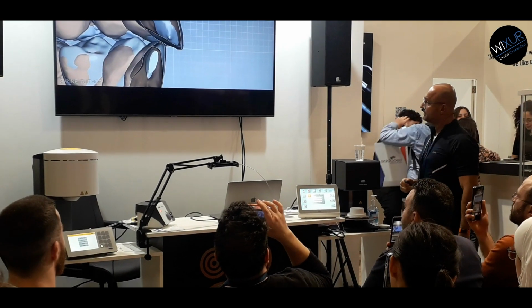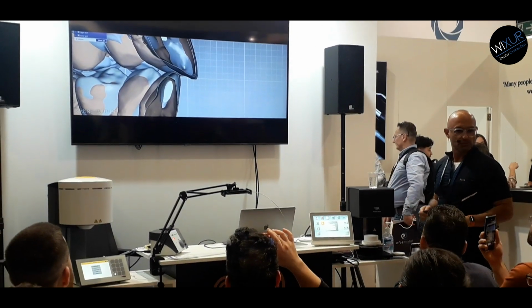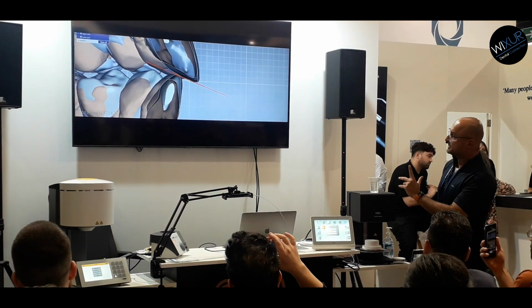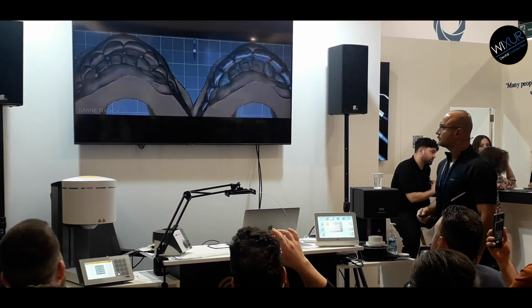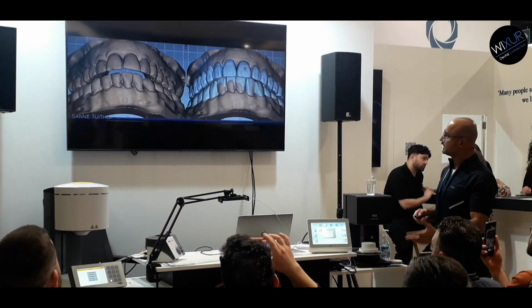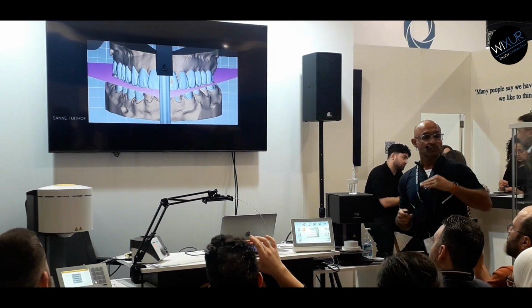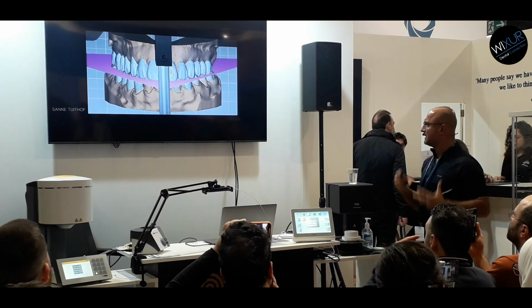It went to the mouth of the patient. Here she said, the teeth are too big. You should make them smaller, okay? The angle is very important. So, I made the second wax up. Now she told me I see too much of the lower teeth. It doesn't look nice in her face because she has a big display.